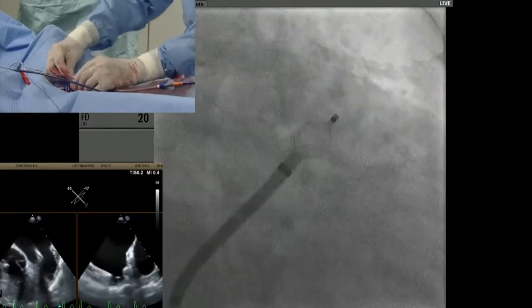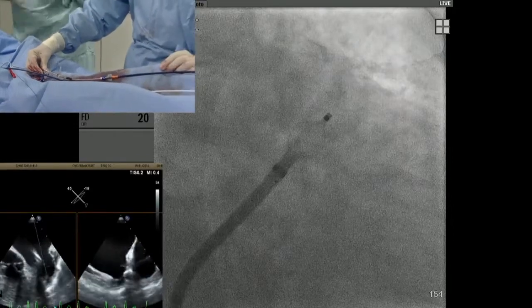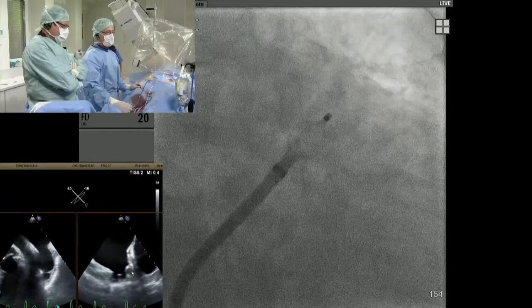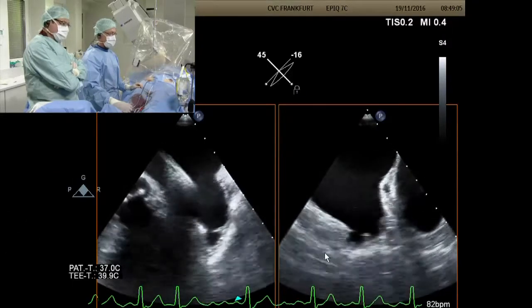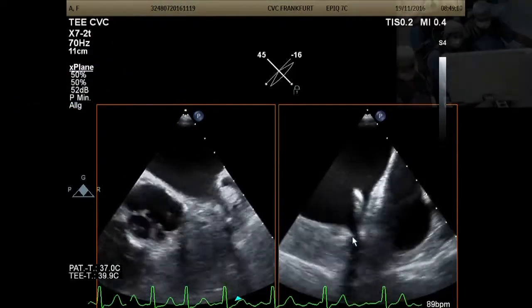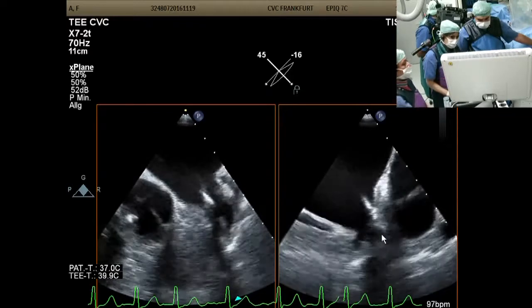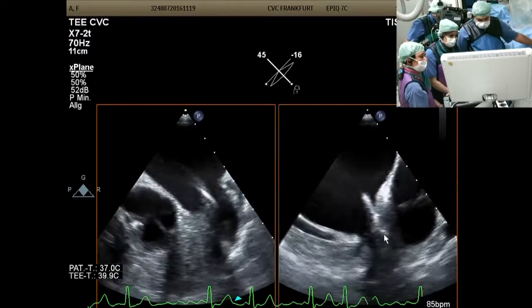I would like to see this little ball, and now ask Busha where this ball is. Yeah. There on the right image? Please, could we see echo in big frame? Thank you. Rolling the probe there, so you can just see back slightly. That's it. Stop there. You can just see the ball is sitting here. We did have a slightly better picture, but it's there, and it's definitely in the superior lobe. Which would be too small to expose it there, so I have to pull it back here.